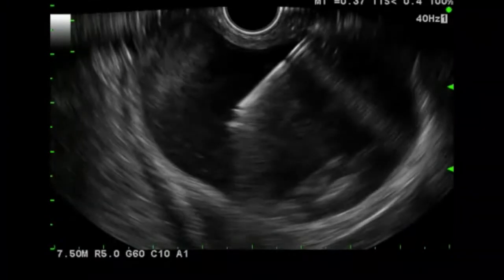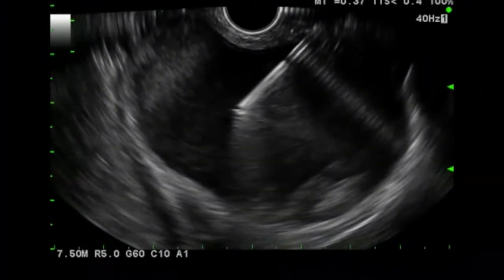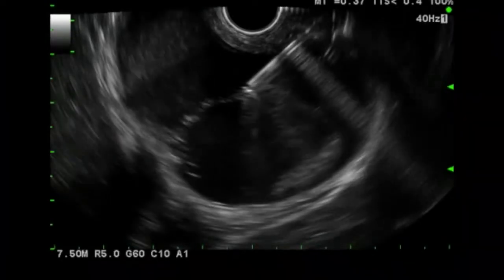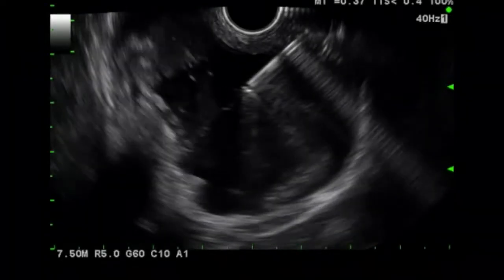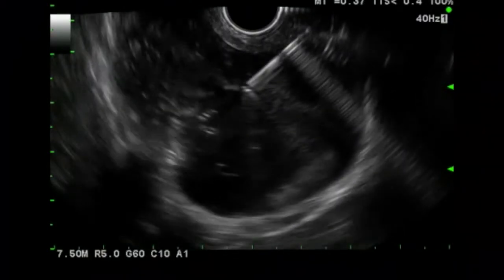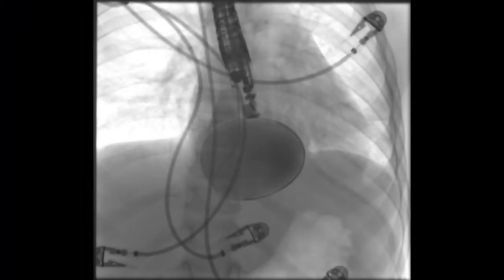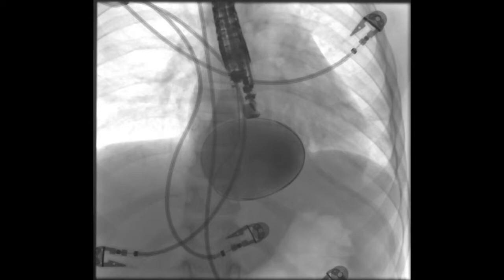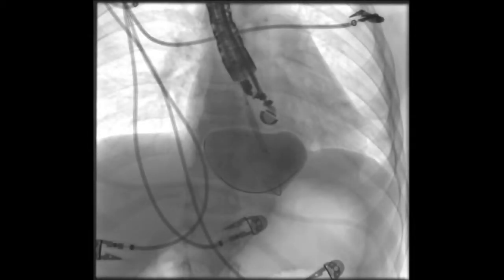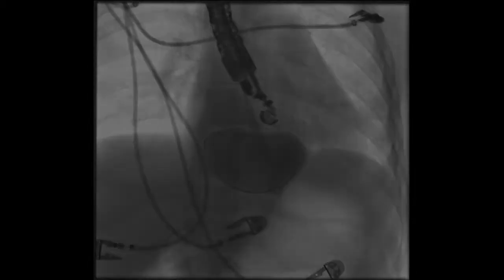A 19-gauge EUS FNA needle was used to puncture the collection. Contrast was instilled to identify the lesion fluoroscopically. A 450-centimeter guide wire was passed into the collection and coiled several times. A 4-millimeter biliary dilating balloon was passed over the wire to dilate the tract.